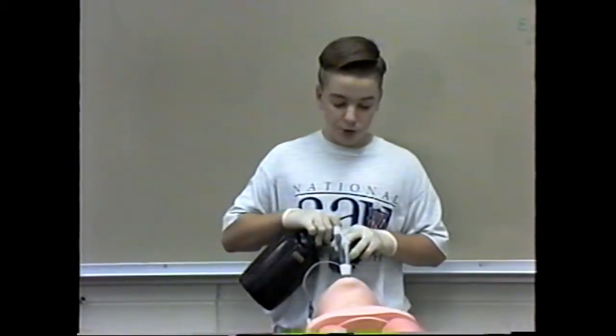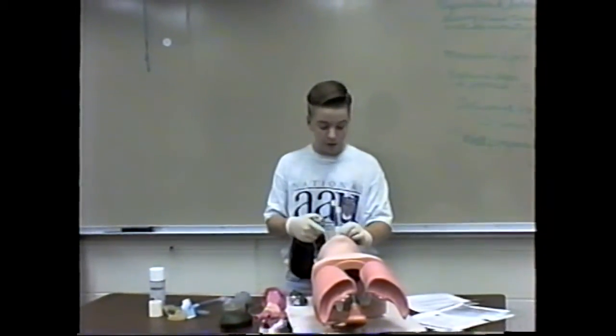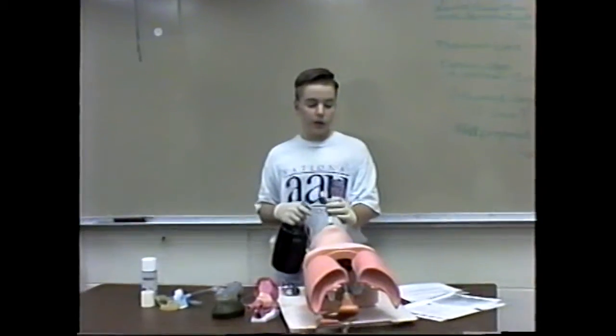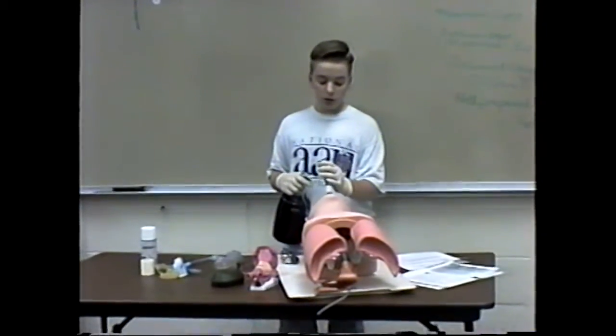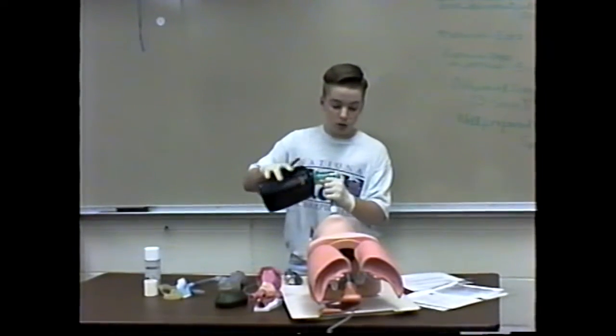The combo tube has two different tubes that hook together right here. One will be in the stomach and one will be in the lungs. You always start out by ventilating the blue one first.